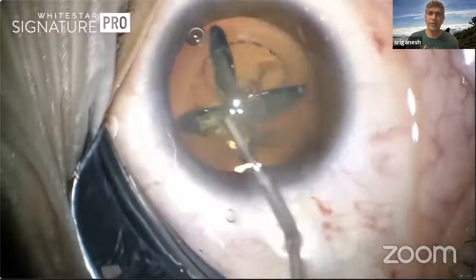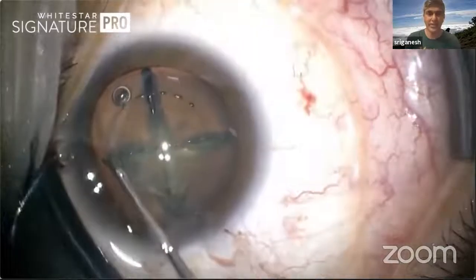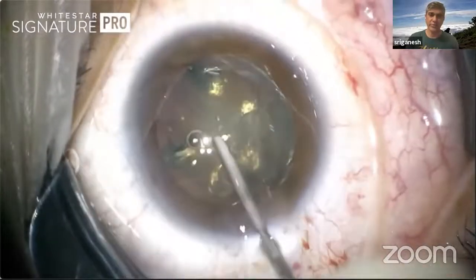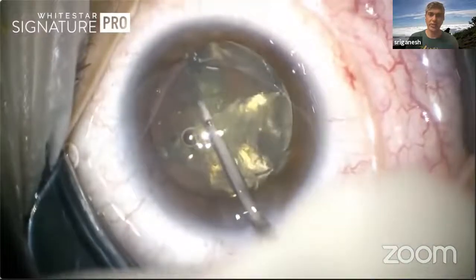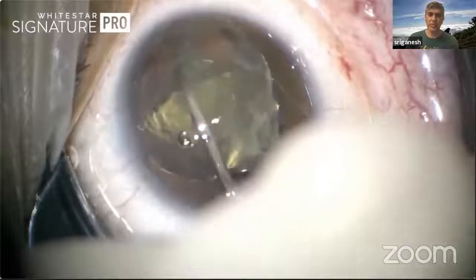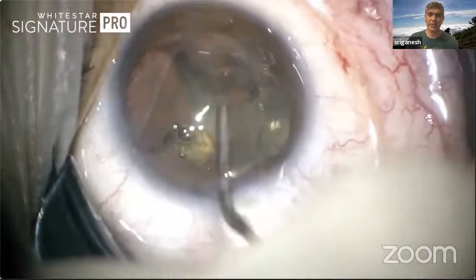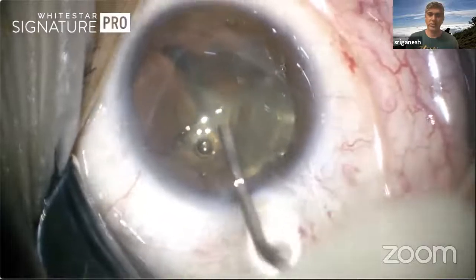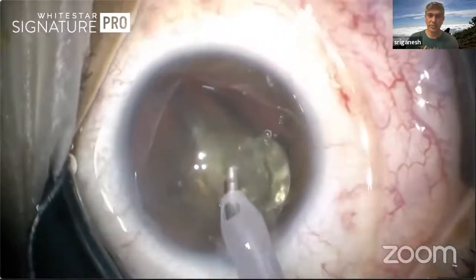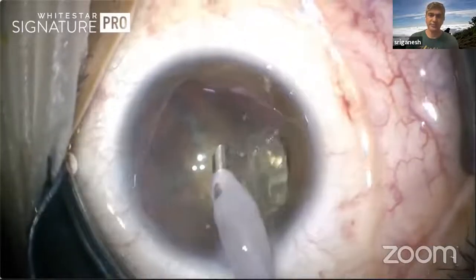It's very important that you use a forceps to complete the rexis, because sometimes there may be tags, especially post-phakic IOL when you do the capsulotomy. And then here I'm using a visco chop technique where I inject visco into the nucleotomy grooves to separate the soft cataract. So this is a technique which I described and published.